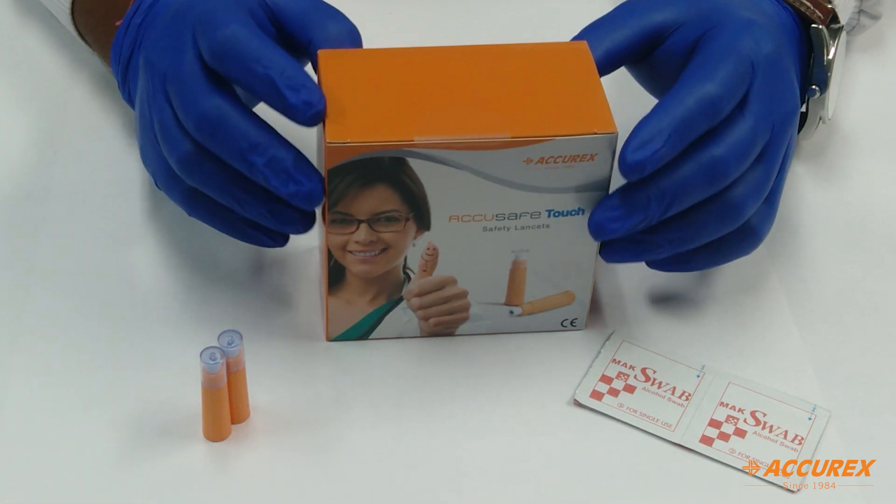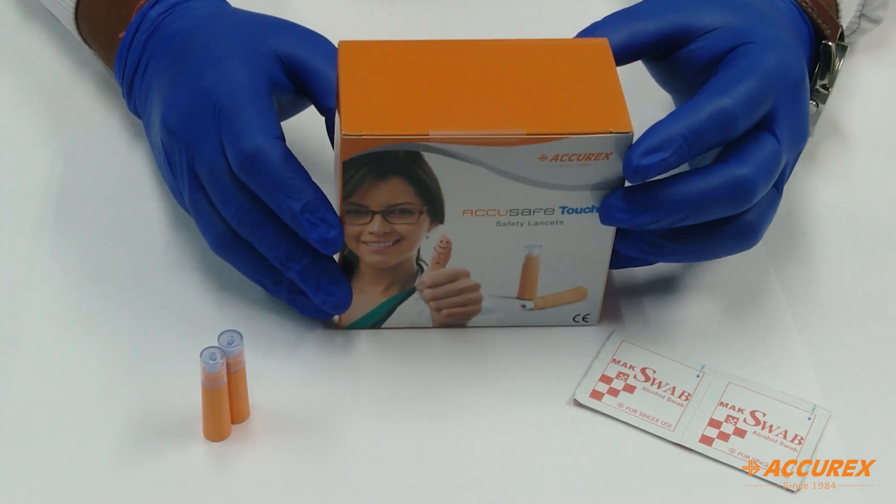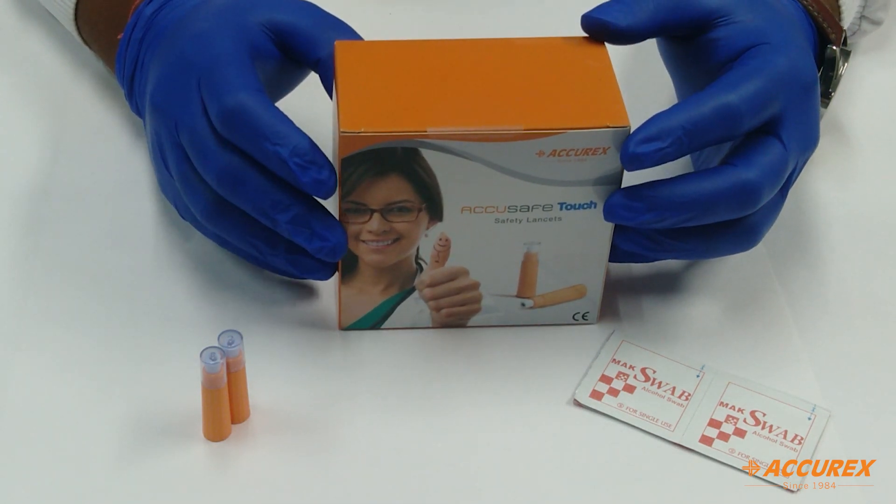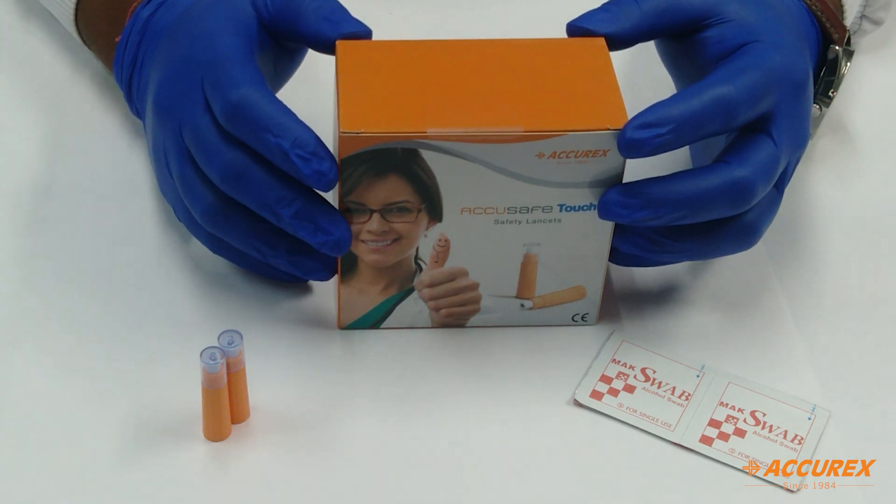This box contains 100 lancets. What is the use of lancet? The lancet is used for pricking the skin and to collect a small amount of blood for testing of POC product.